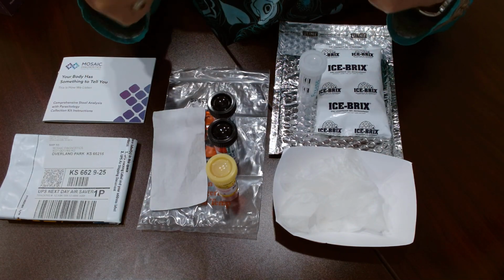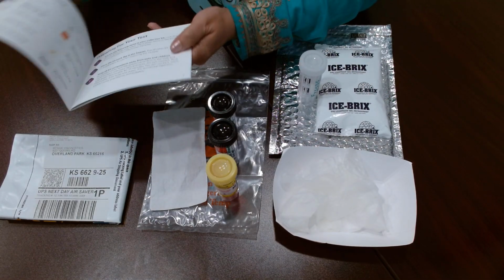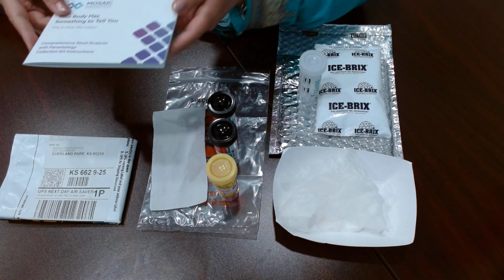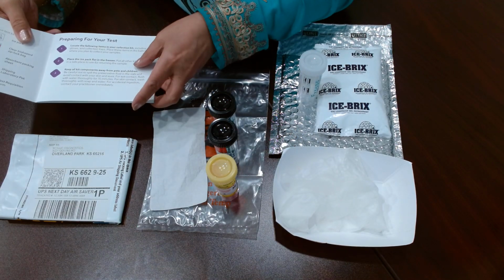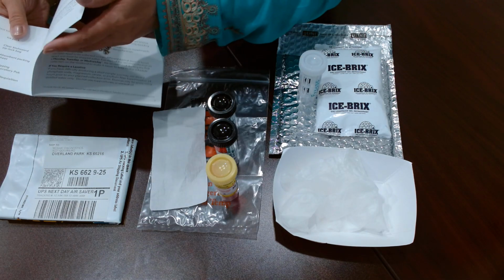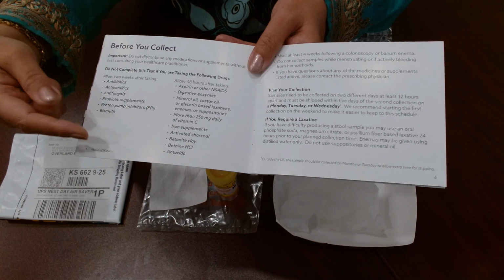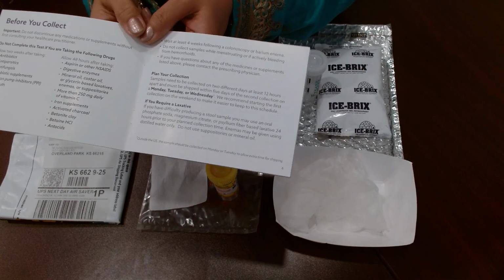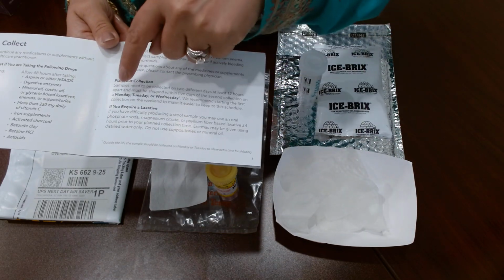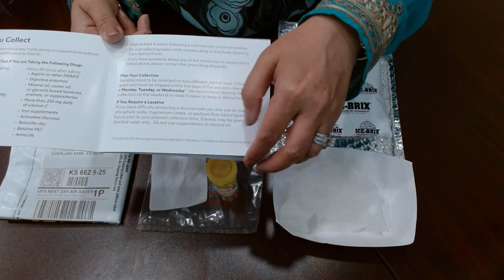This test has you collect a stool sample twice, at least 12 hours apart. And in the booklet, it'll give you all details. I always recommend that you please read the booklet at least three times before you start collecting the stool. In a nutshell, they're saying to prepare, you freeze the ice block beforehand, and of course it goes over what you should not be consuming. We'll go over all these things with you and tell you specifically what needs to be stopped. And then, of course, we must always plan. They're mentioning over here to send it out Monday, Tuesday, and Wednesday. Don't send it out on a Thursday because it may not get received.